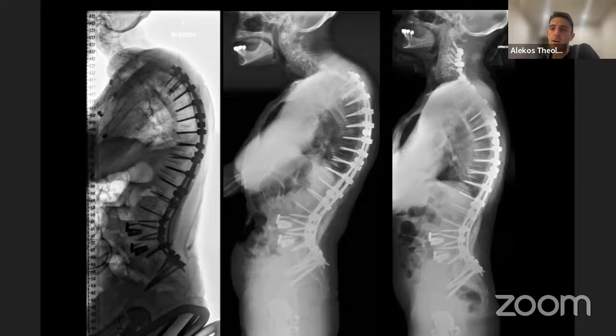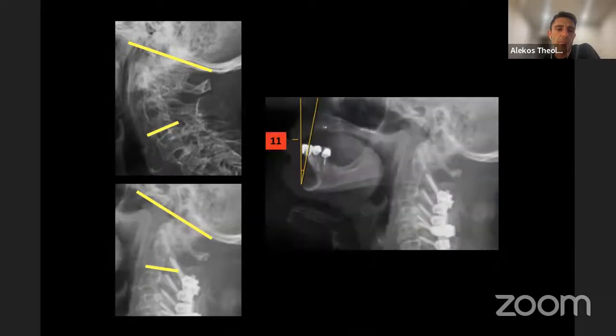And I think we may have overcorrected her in some ways, maybe a little bit too much lordosis through the subaxial spine. I thought that some of her residual looking a little bit towards the sky was because of her OC to C1 not relaxing, but it looks like it's quite open. It's parallel, so I think we just overcorrected her.